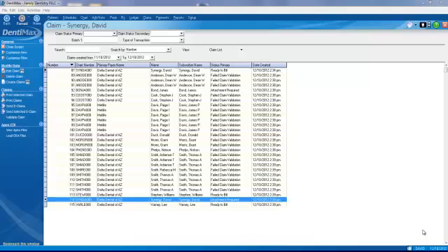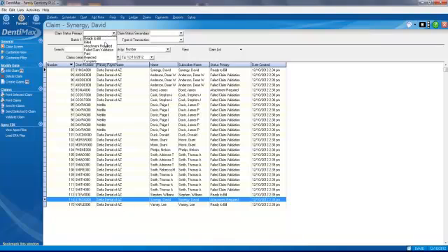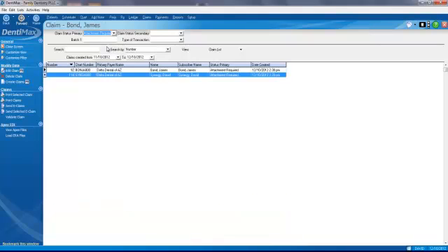So let's go ahead. We're going to go to our claims manager, and I'm going to filter my claims by attachments that are required.